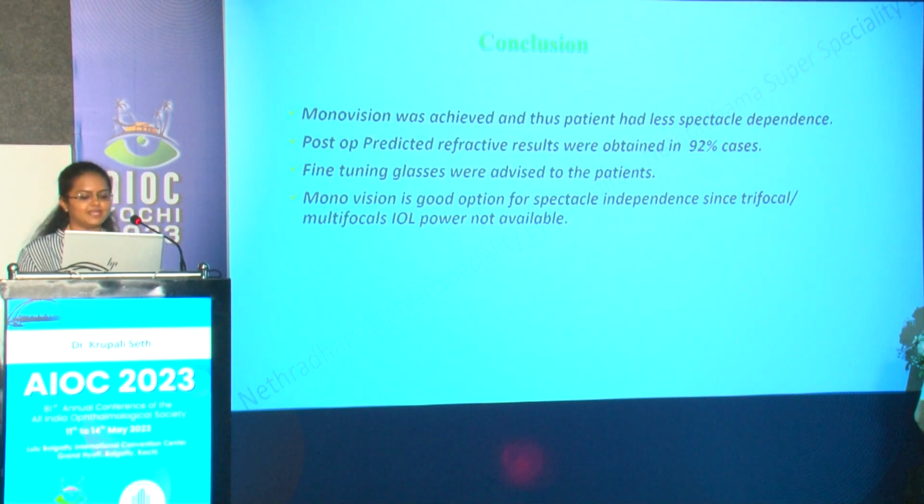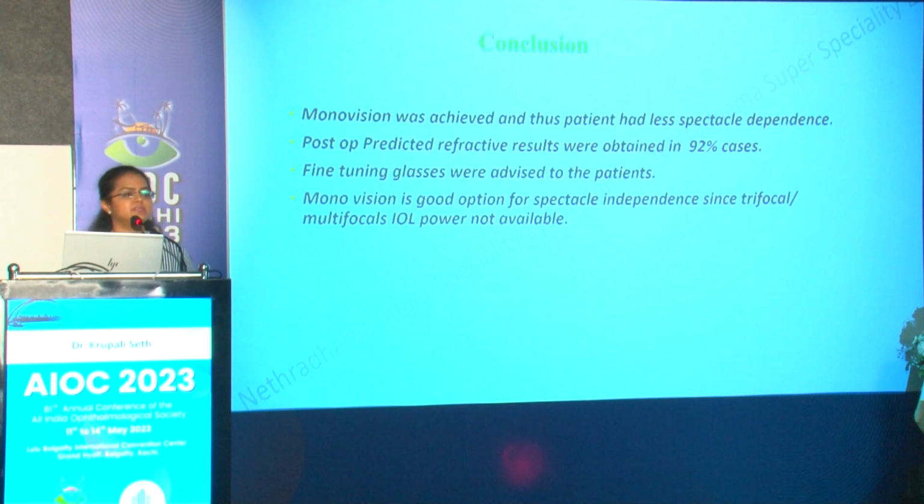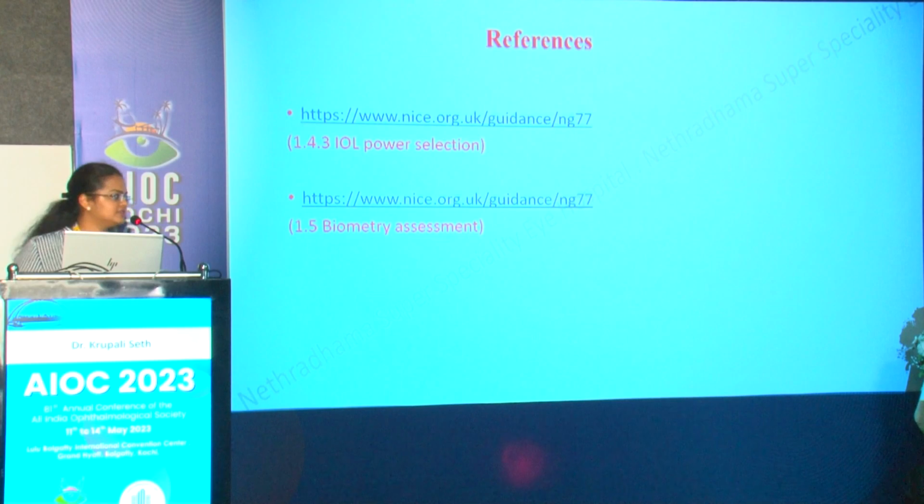Fine-tuning glasses were advised to the patients, and monovision is a good option for spectacle independence because trifocal and multifocal IOL powers are not available in such high myopes. These are the references. Thank you, sir.